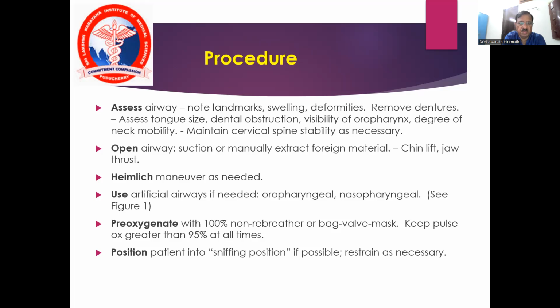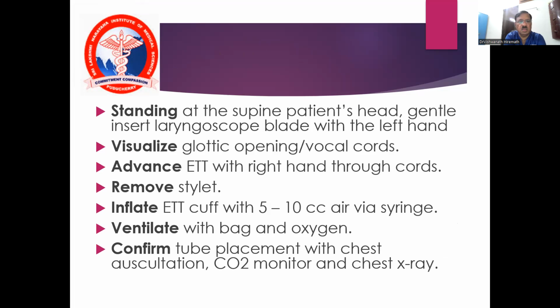The patient should be adjusted into the sniffing position if possible. Then for the procedure as such, the physician will stand at the head end of the patient in a supine position.